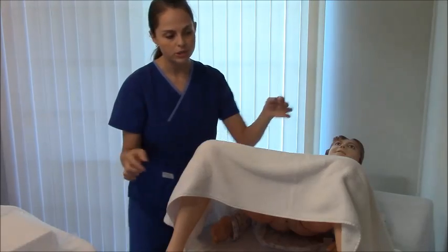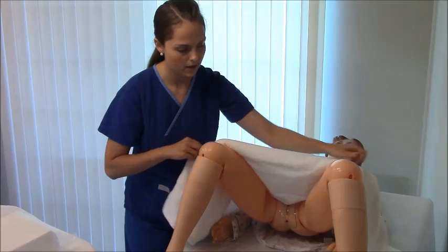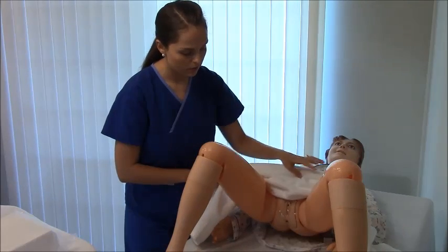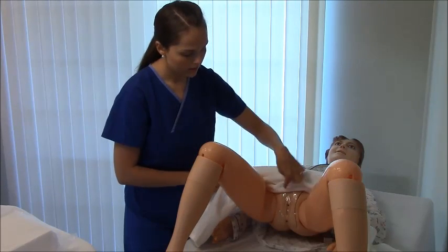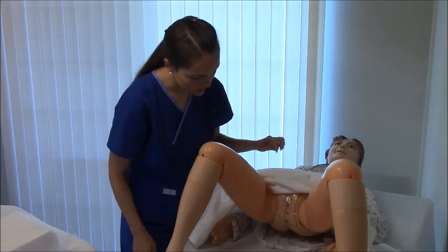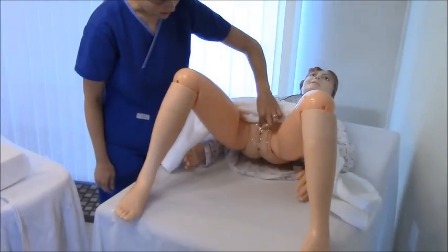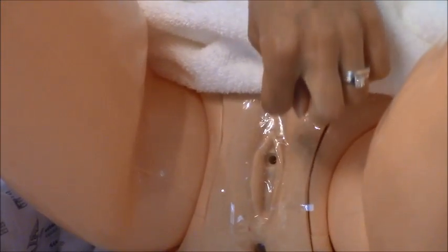Pull the towel back and expose the labia and vaginal area, letting your patient know everything you're doing. On a female patient you have two labia, the urethra which is the entrance to the bladder, below that is the vaginal area, and then the anus at the bottom.